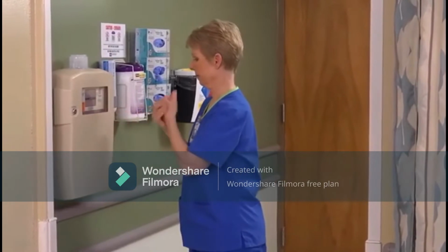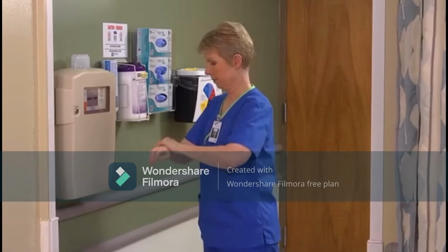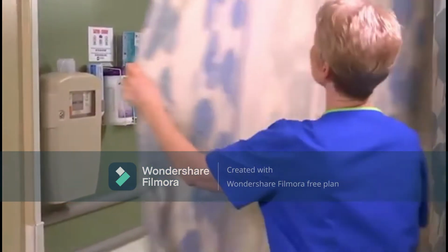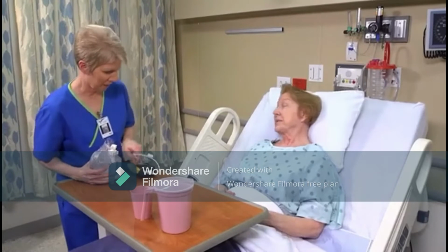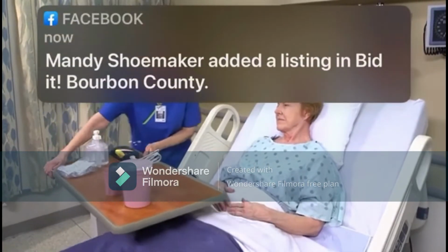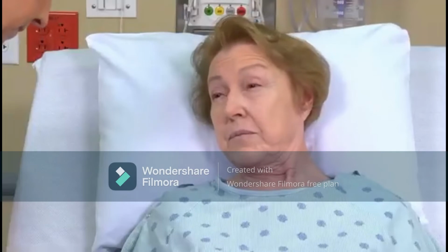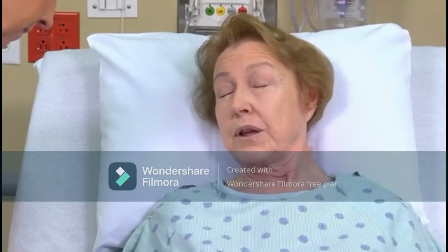Perform hand hygiene. Ensure privacy and introduce yourself to the patient. Good morning. My name is Cindy, and I'm going to be your nurse today. Then identify her using two identifiers. Tell me your first and last name and your birth date. Beverly Hampton, and my birthday, January 8, 1948.